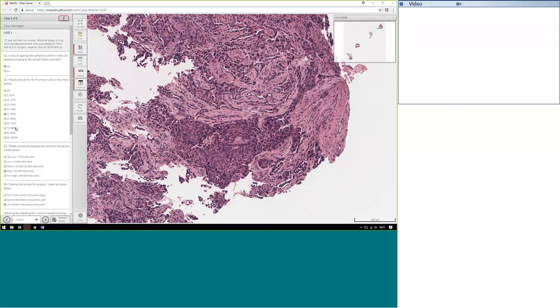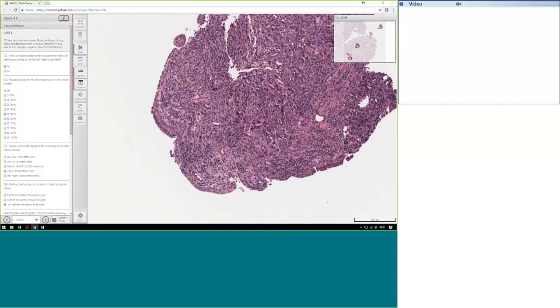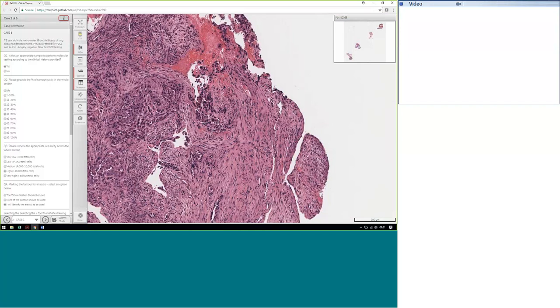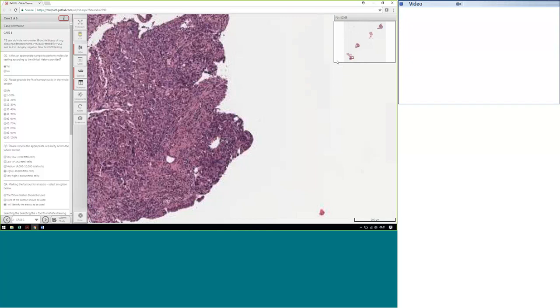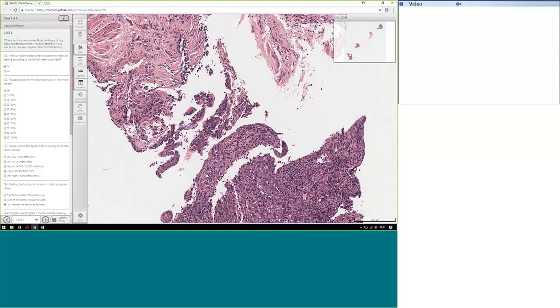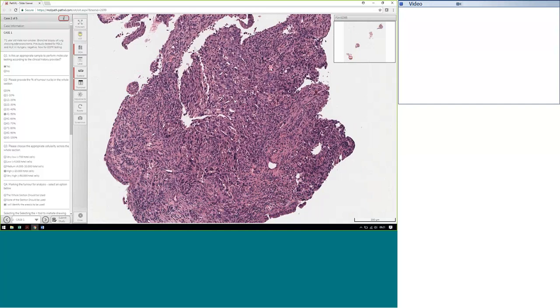So for cellularity, the experts thought that there would be a medium amount of cellularity in this, again assuming 10 by 5 micrometer tissue sections. I can see where some people might think it's low. Certainly if we were taking less than 5 micrometer sections, it would be low. So certainly low to medium would be acceptable in the estimation of the cellularity.